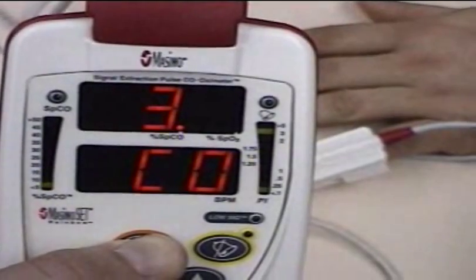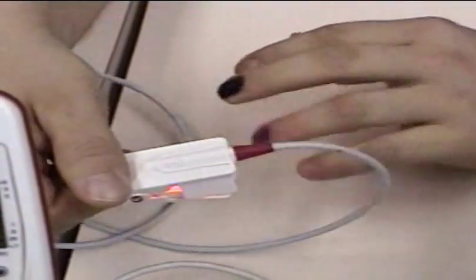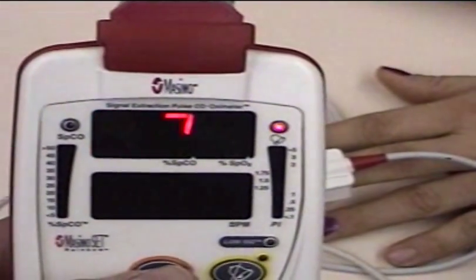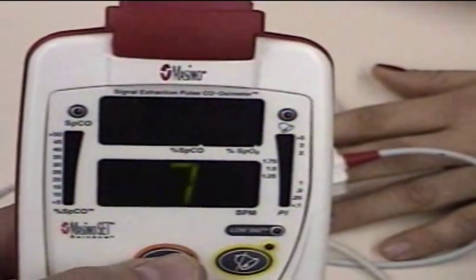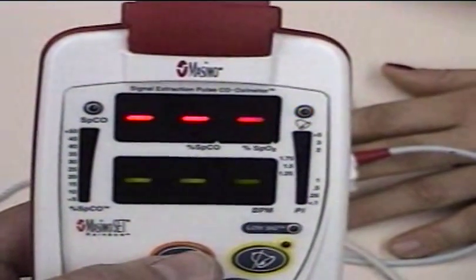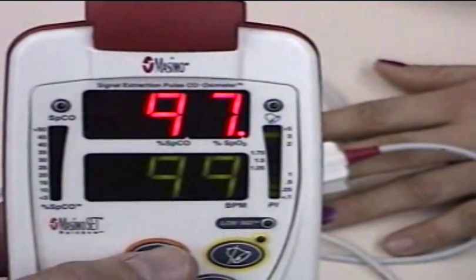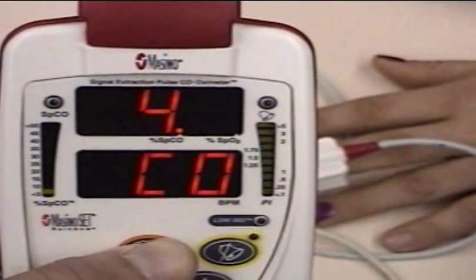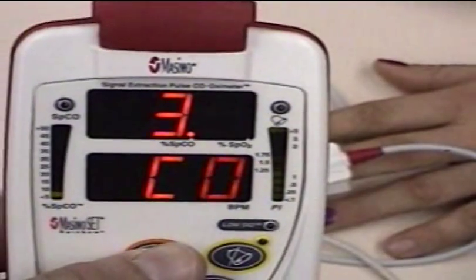Why don't you go ahead and switch fingers — pick that black one. 97%, CO at 4, then 3, then 4. So it stayed about the same.